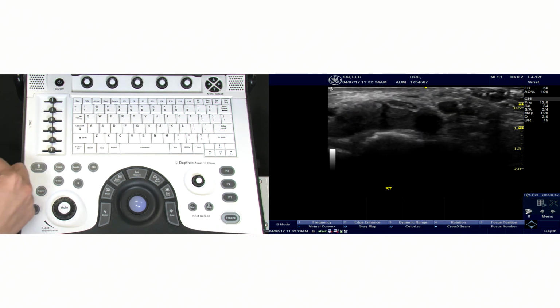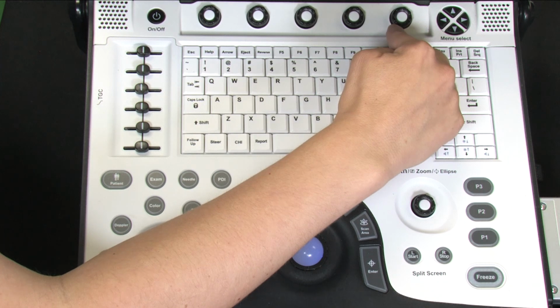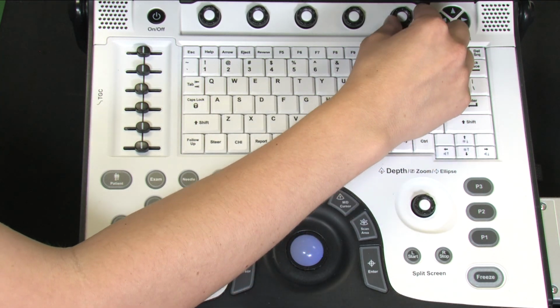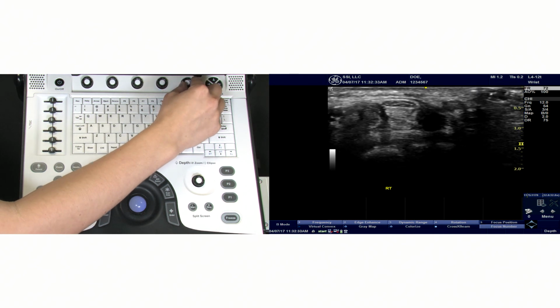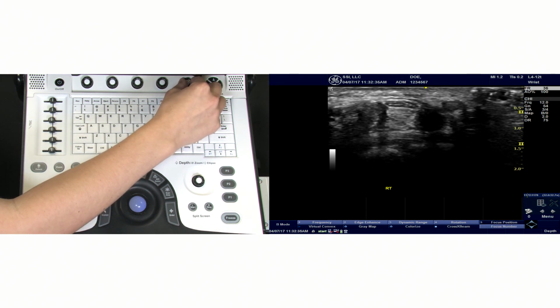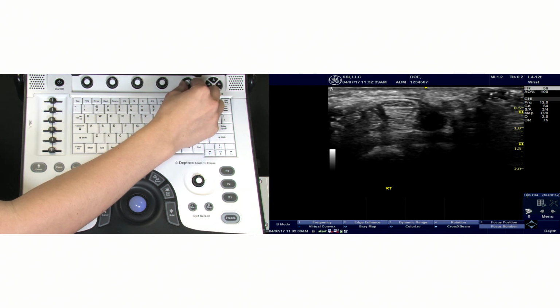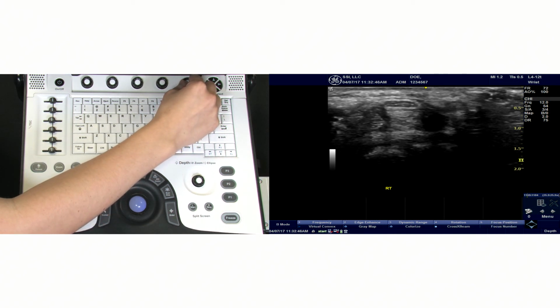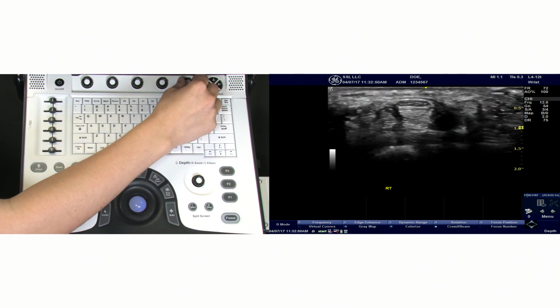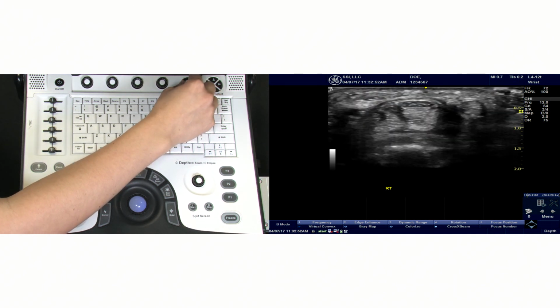One of the most important functions on a modern ultrasound machine is the focus. This is also known as the focal depth. You can add the number of focuses, or subtract them, or move them top to bottom on your screen if you notice the hourglasses off to the right of the ultrasound image. This helps the sonographer get the best resolution at or below the level of those hourglasses.